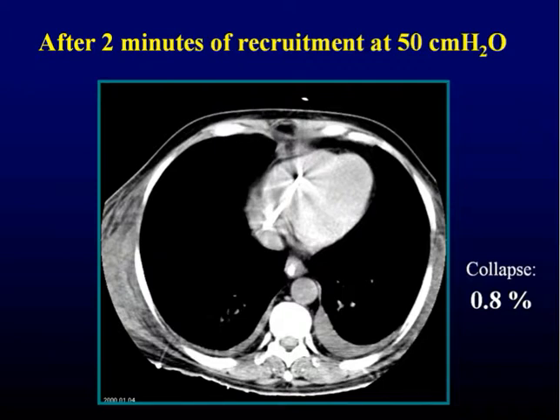It's a completely empirical result, but in our practice, whenever you need 60 centimeters of water of pressure to recruit, and you still have some collapse, it is very difficult to gain additional recruitment with higher pressures, except in very selected cases. So with this range of pressure, you are recruiting most of the patients. High pressures are probably only for very selected patients where you have a lot of problems ventilating without recruitment.